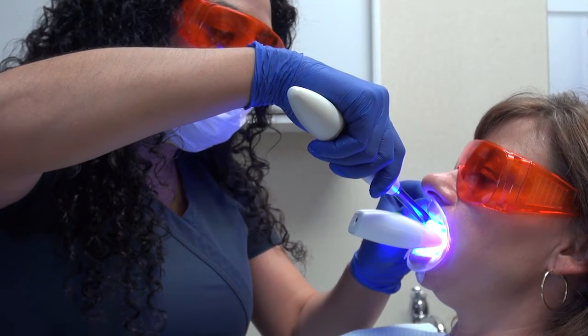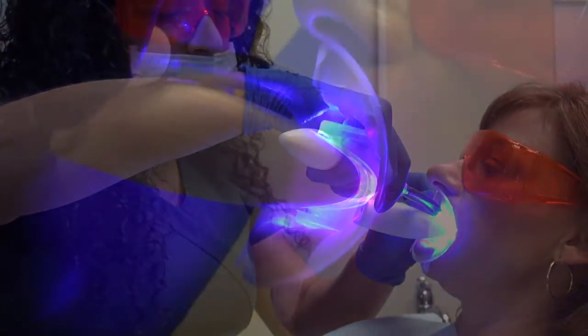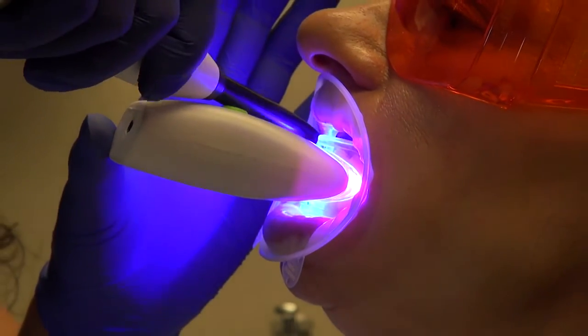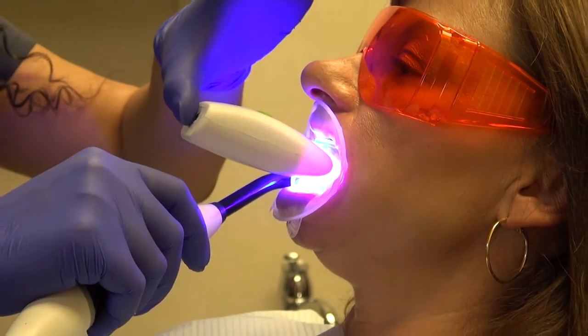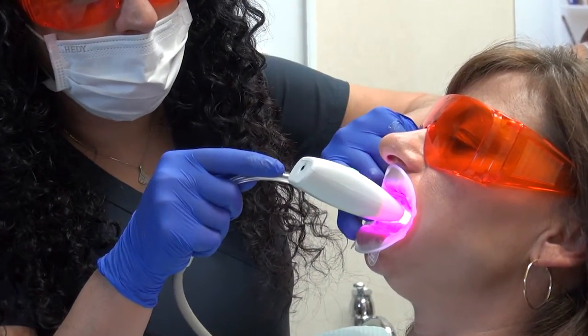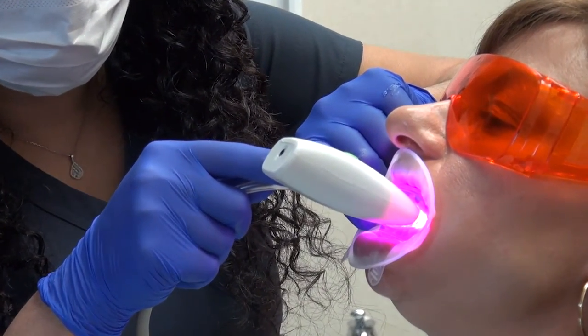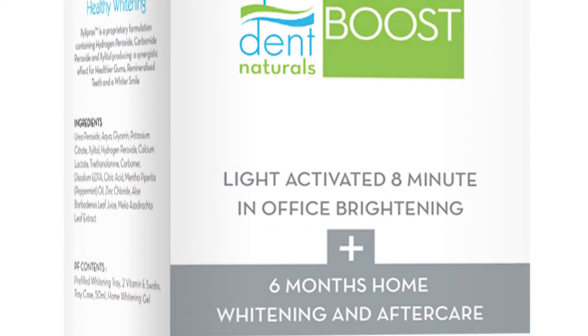To boost acceleration, use an LED curing light for a 5-second pass corner to corner on the upper and lower arch and repeat. Provide another curing boost by repeating that step at the 5-minute interval. Frequently check on your patient and use suction as required. After 8 to 10 minutes, the brightening session is done.